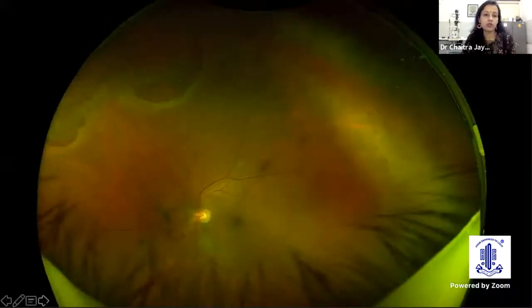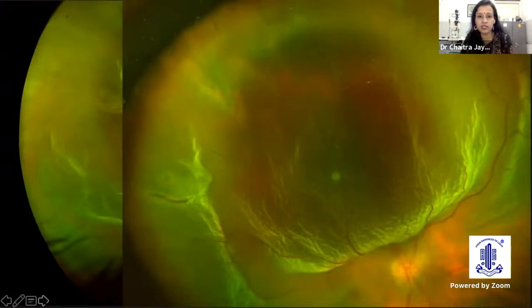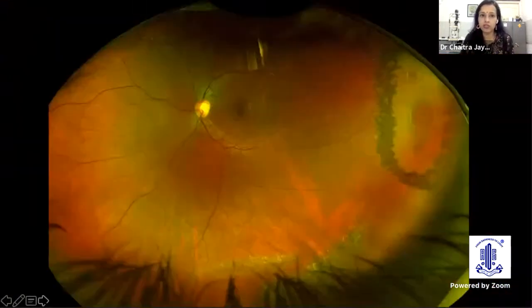Here is one patient who came with multiple tears. Some of them, this was actually PVD-induced post-inflammation. So rather unfortunate, but we caught it on time, could laser the patient. Now, this is a patient with bullous retinal detachment, and we can show them why it has occurred. We can show these linear tears that the patient had, another horseshoe tear. They understand the requirement for surgery. This is post-laser, again, to document.